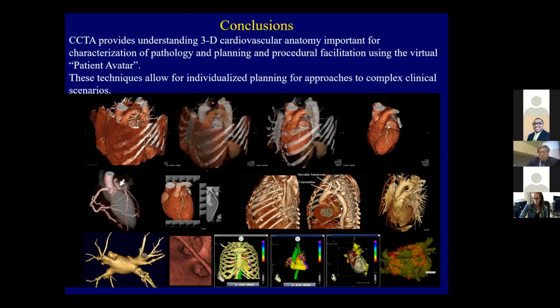It can be used to rule out coronary artery disease, and we went through some of the guideline criteria for that. It may have some application in the emergency room, but again, this may be more limited by the fact that the high sensitivity troponin evaluation is so good. And again, for us and in centers doing complex procedures, it's profoundly helpful as an avatar to help make diagnoses and then help plan and guide these procedures.